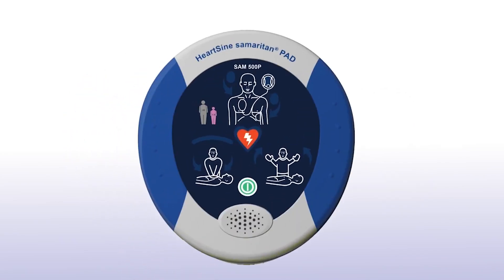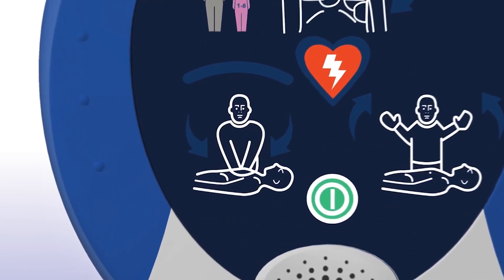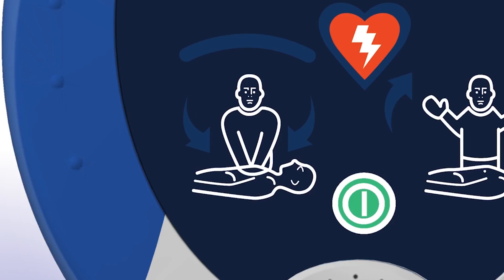When performing CPR, it's important to apply effective chest compressions for each 2-minute cycle, as directed. The SAM 500P with CPR Advisor will prompt you to begin CPR and will continue to do so until you begin chest compressions.